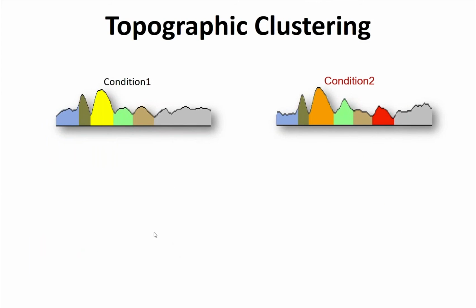Practically, what that means is you can go back and relabel your conditions or groups as a function of time with different maps. It could be blue. You can use colors, you can use letters, you can use whatever moniker you want to use, but it gives you a hypothesis at, in this case, the group average level for what's happening, let's say, in condition 1 versus condition 2.